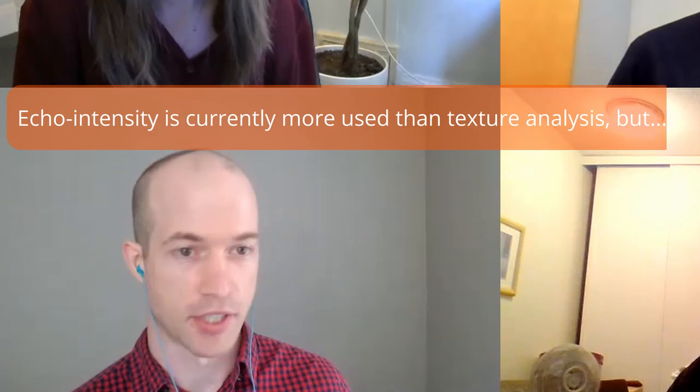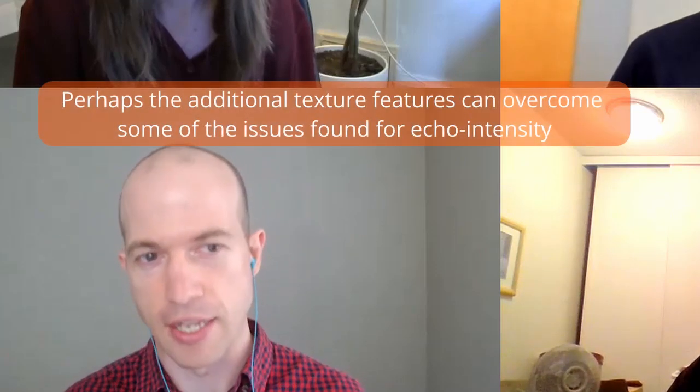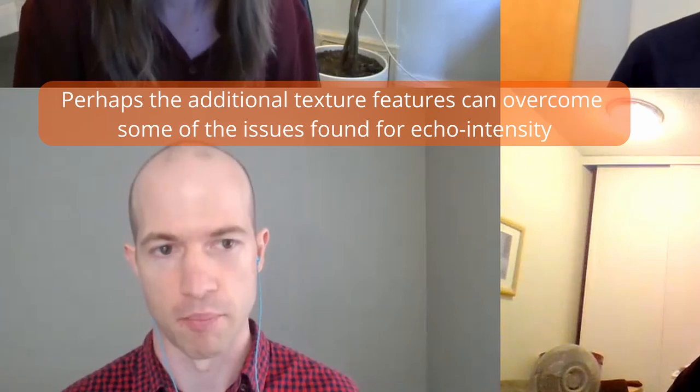But as we've discussed, there are a lot of issues with echo intensity, like patient characteristics, like the adipose tissue. And so perhaps these additional texture features can overcome some of these issues.